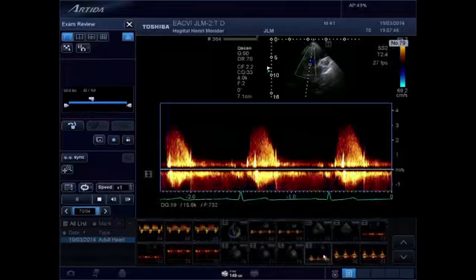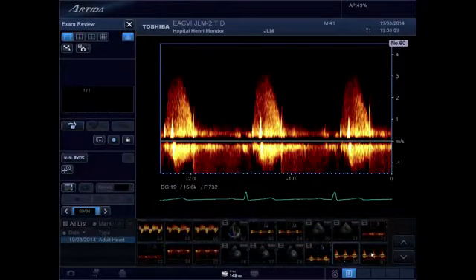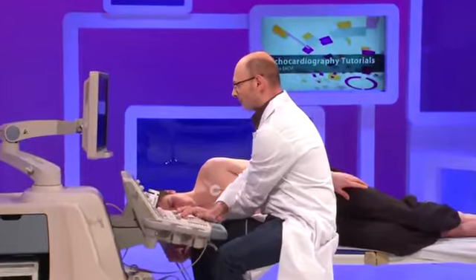We check with the continuous wave Doppler the peak velocity, and we also measure the mean gradient. We had 3.3 by the apical view, and here we only have between 3.1 and 3.2, which is lower, and so the maximal velocity was recorded in the apical view.